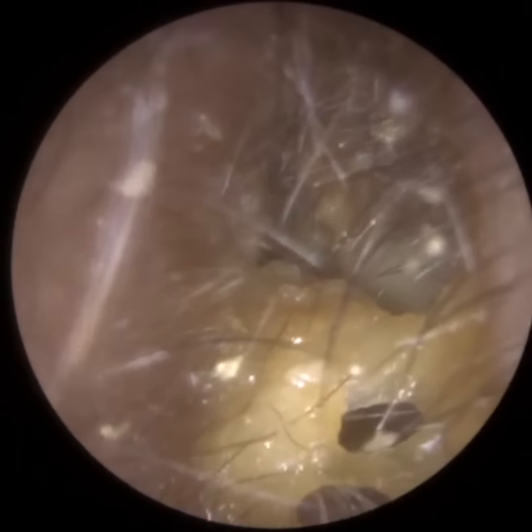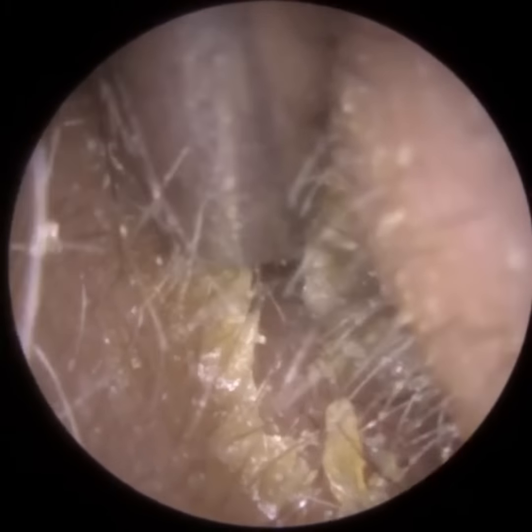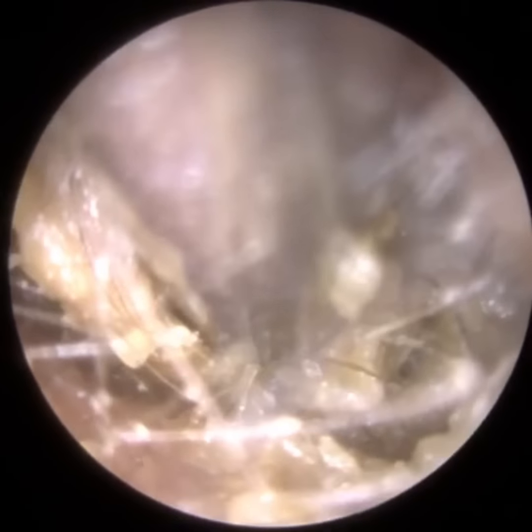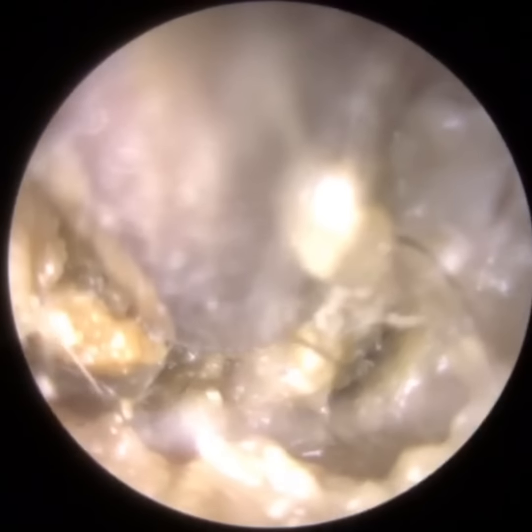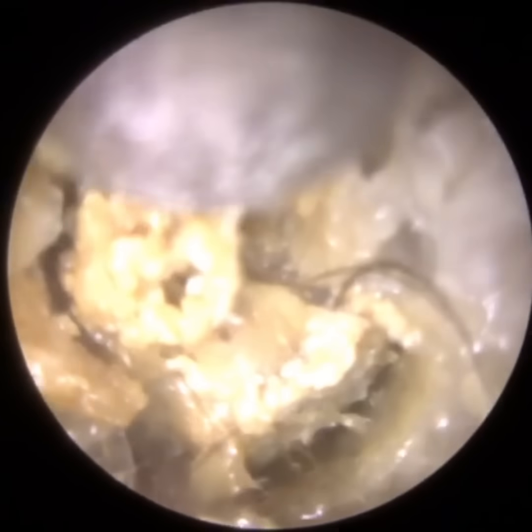So, a patient who attended with infected Keratosis obturans. Keratosis obturans is a build-up of dead skin, which in most people would die and shed and migrate naturally out of the ear. But in people who suffer from Keratosis obturans, this dead skin that dies and sheds in your ear canal doesn't naturally migrate.